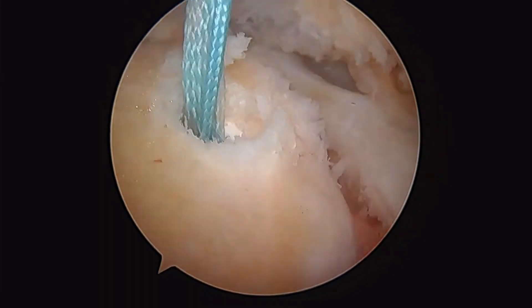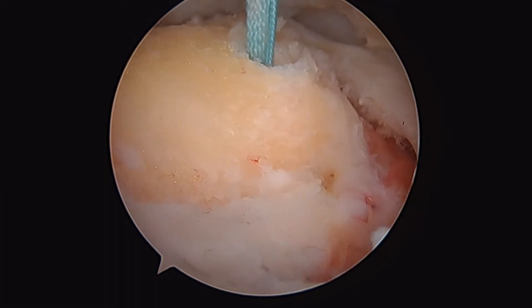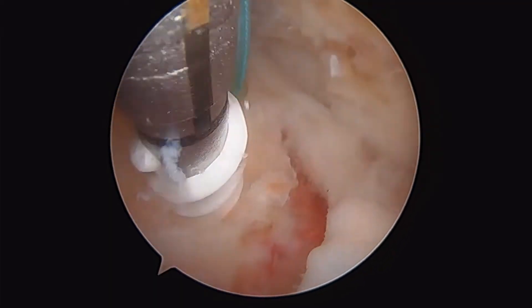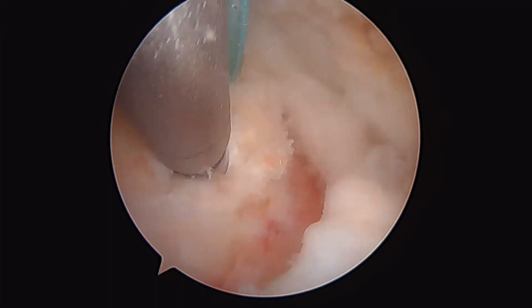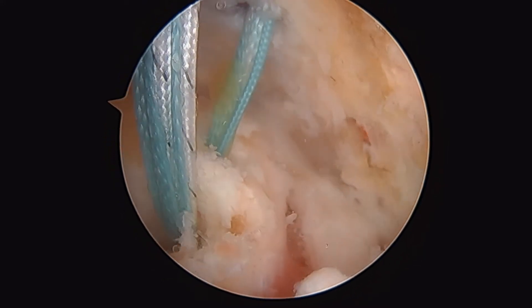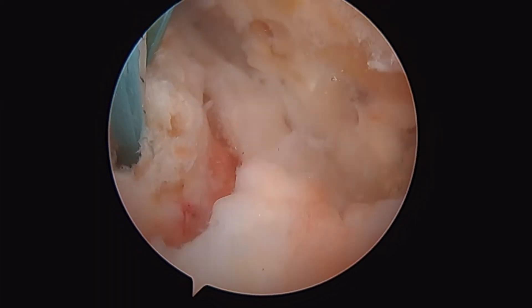I'm really pulling on that — that's in there. That's the first one of our medial row. We're going to put another one right here. There's a pretty good look at our two medial row anchors there to repair the cuff.